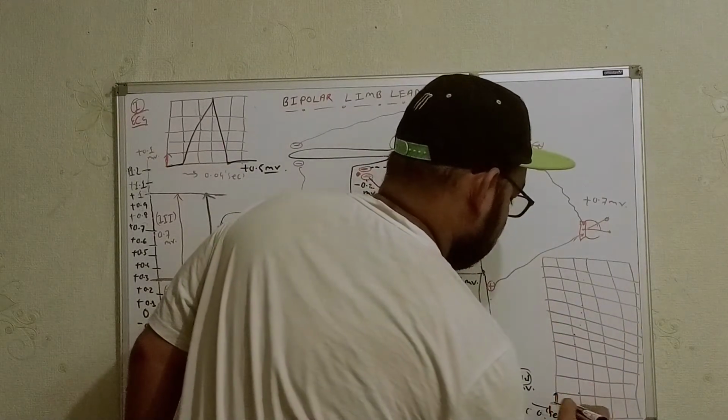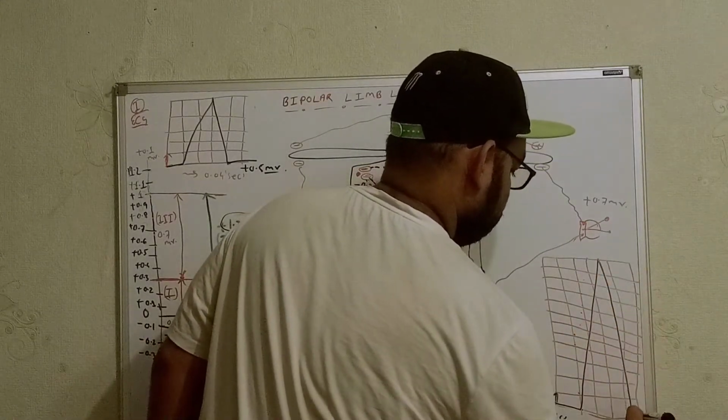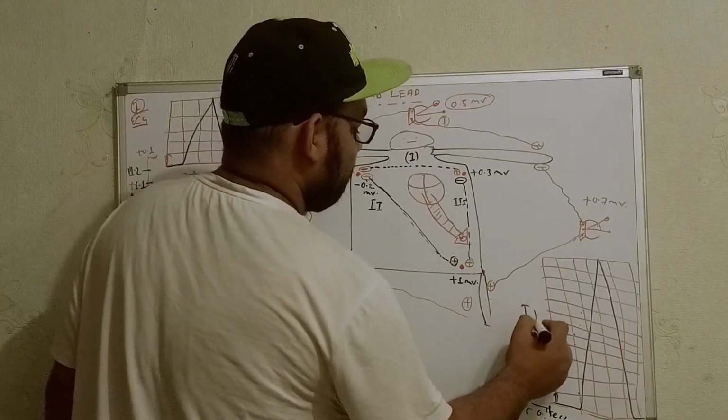So we will get it in this way. Okay, so it will be the physical representation in terms of lead number 2. It will be lead number 2.